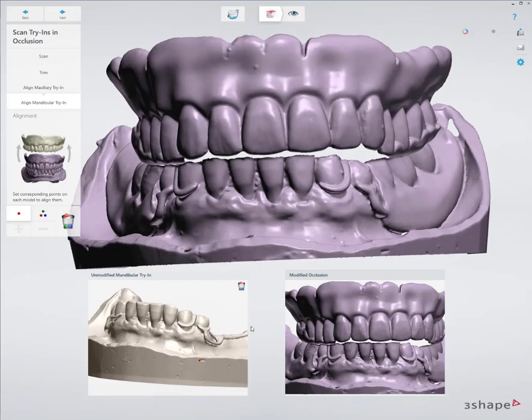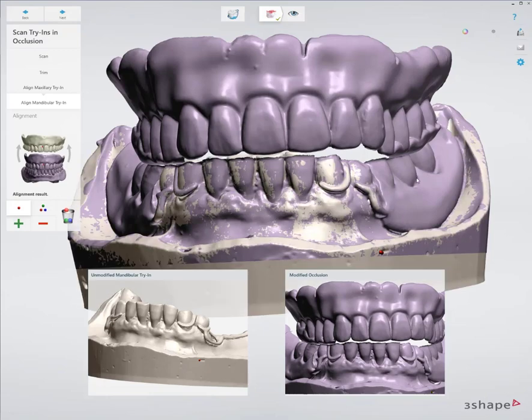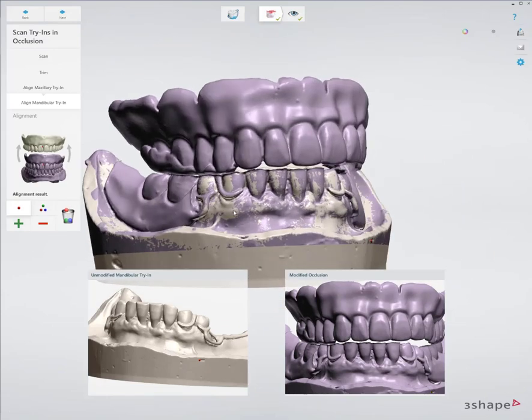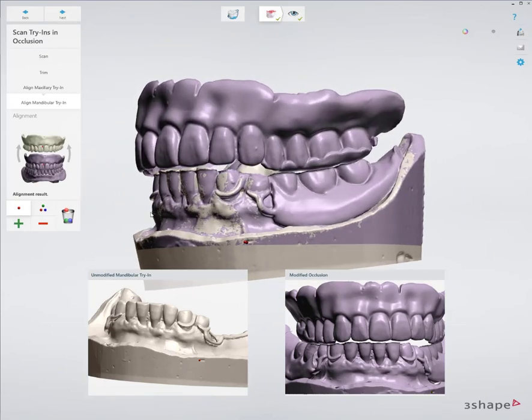And once I have it aligned to the model, I can just click design and my entire design is still there. It just has the new and accurate bite.